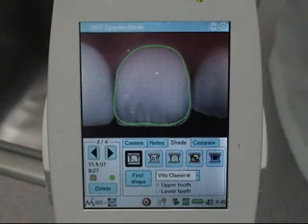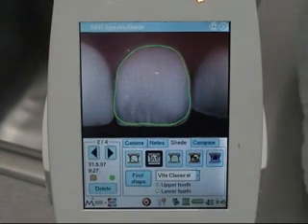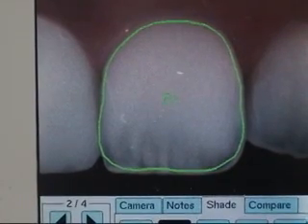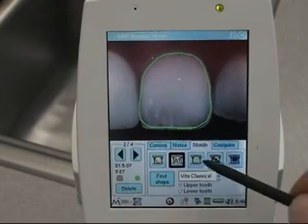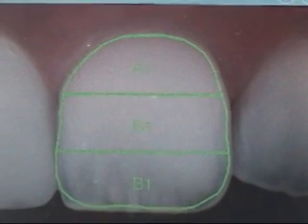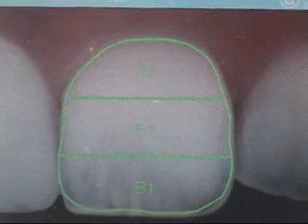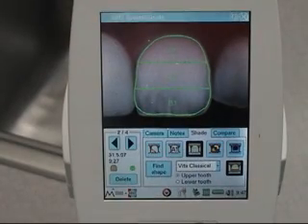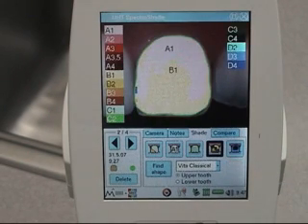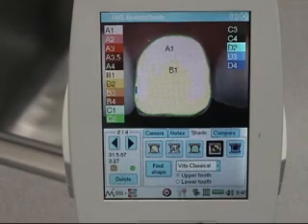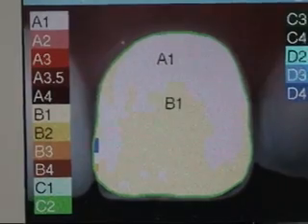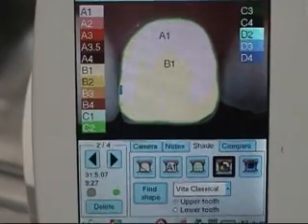The SpectraShade system also allows for a quick shade analysis on the unit itself, as opposed to transferring it to the computer. The unit can find an overall shade, shades separated into the gingival, body and incisal parts, a coarse shade map, and finally a translucency map.